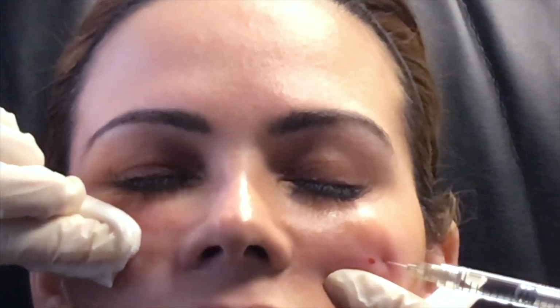We're going to use just one syringe of each today, but depending on a person's age, you really can see the need for even as much as 4 to 6 syringes of various products depending on where their loss is and also, of course, their age, their level of volume loss. Tara's in her 30s, so it makes sense that when you have somebody in their 30s, usually you're going to use at least 2 to 3 syringes to replace volume loss. So I think we're there when it comes to her cheeks, but now we're going to use the rest of this product to give a subtle improvement in her temples.